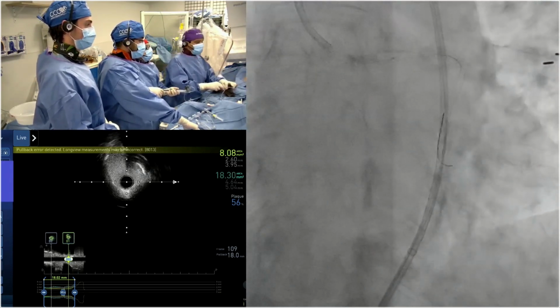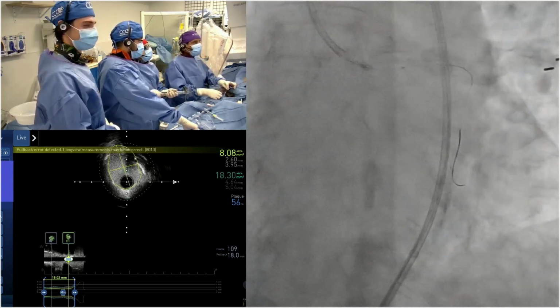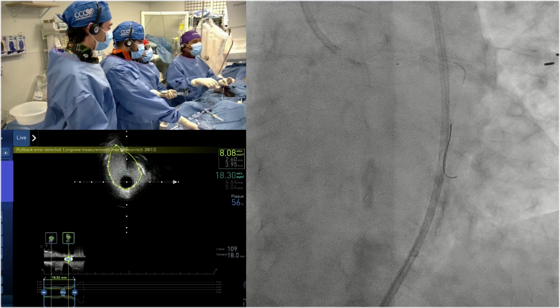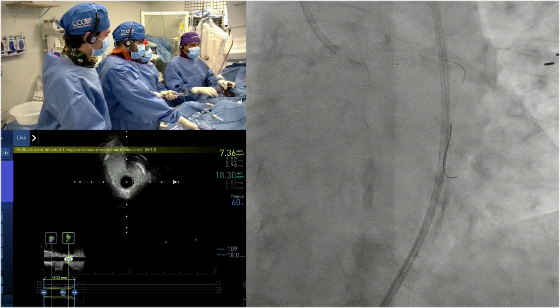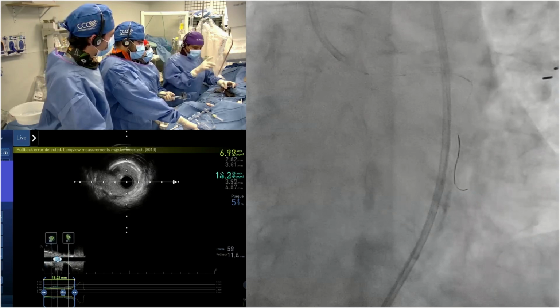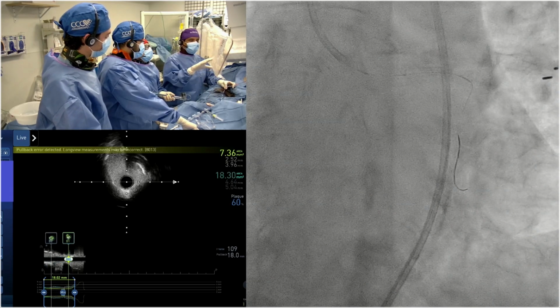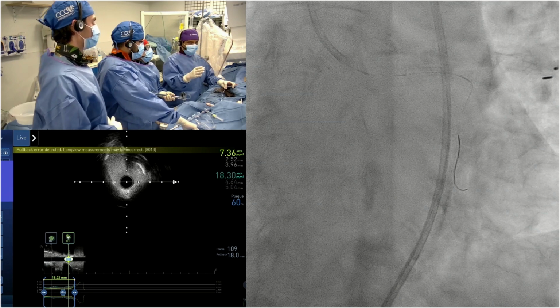Yes and no, but just to say the importance of the imaging. The key is the data from NCDR. They've presented the data on experienced people who are more than 5 years, 10 years, or senior. It turns out the benefit of imaging is across all groups, but was significantly higher in people in practice less than 5 years.